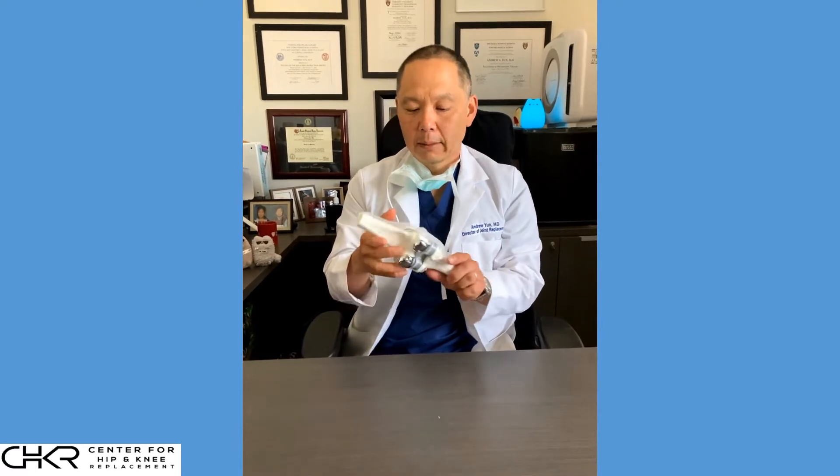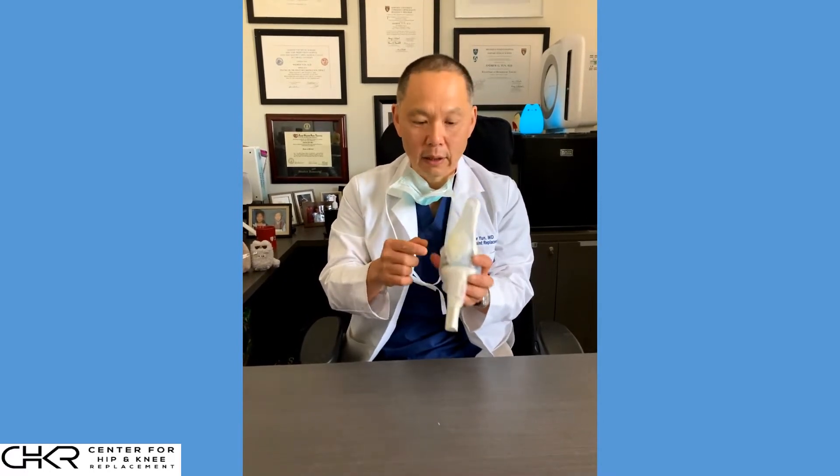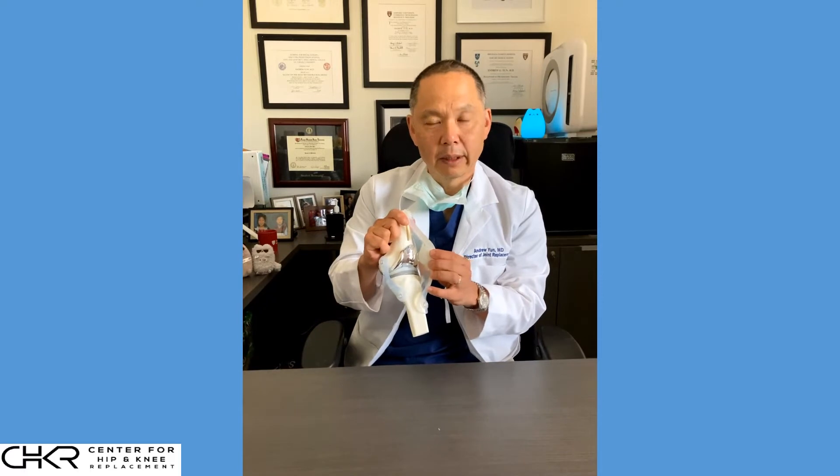Let's spend a few minutes talking about what a total knee replacement is. I'm going to take you through a brief model so this will be a very short discussion, so you get a physical idea of what we're doing inside. This is a model of the knee — we have three bones: the femur, the tibia, and the patella. These three bones make up the knee joint.